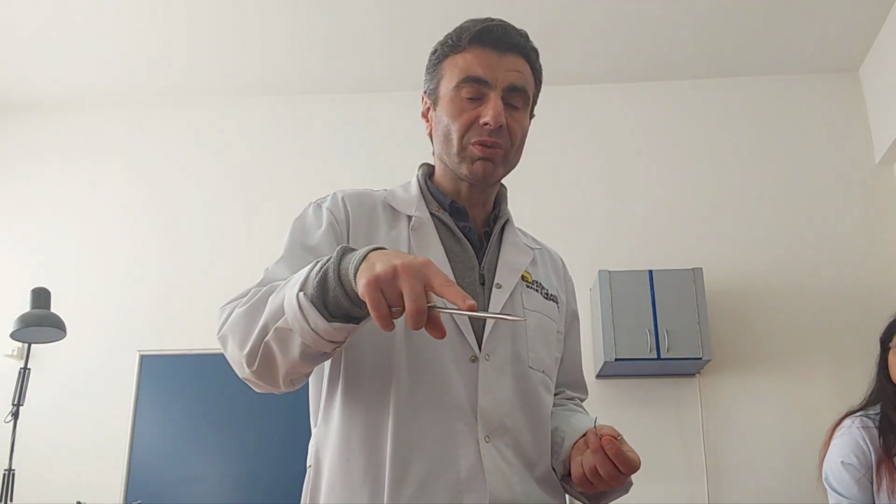It's like any lock instrument. It is closed and opened by different movements. Usually you insert your first and fourth fingers inside of the branches. If the instrument is short, you put your finger at the cross point. If it is long, you put it in the branch. Why? To prevent tremor movement of the fingers, for fixation.